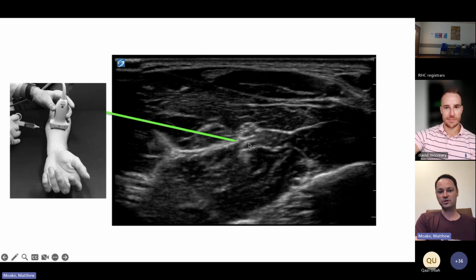And really my target is usually just below and ideally just a little past my nerve, especially when I'm using the hypodermic needles. The reason is that these needles are going to have a little bit of a fire hose effect. As you start injecting, they're often going to push your needle out a little bit. So I like to be a little past if I can. So if they push me back, I'm right where I want to be.